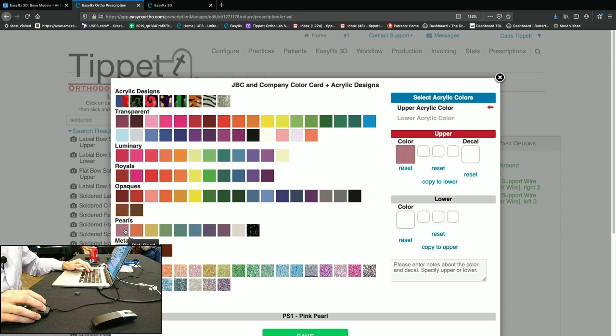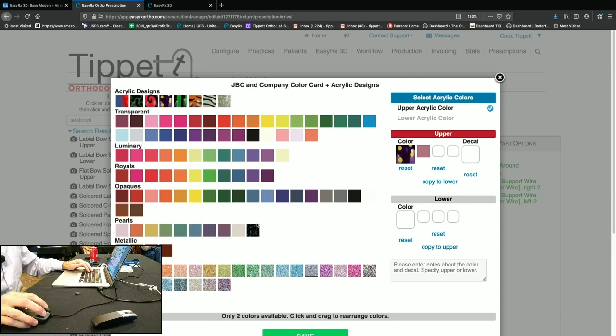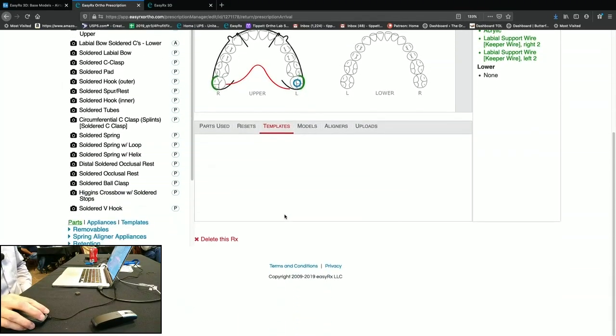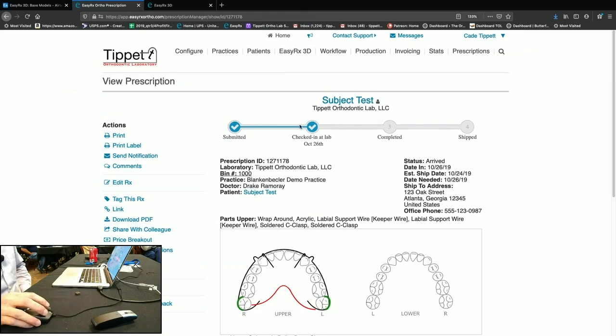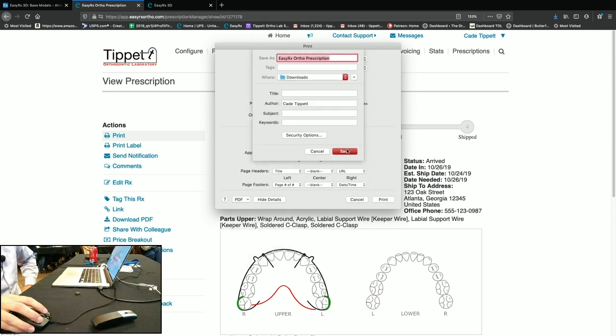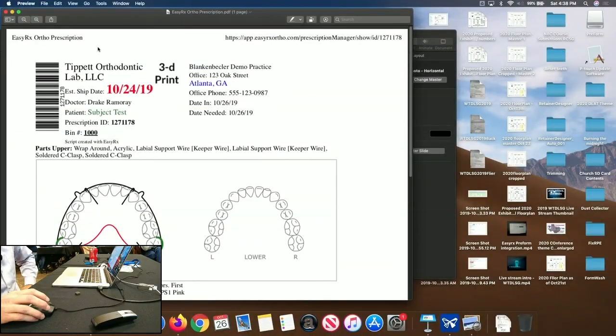So we can do pearl. You can even do half and half or polka dots. So let's say if you do polka dots, you can choose the base color, pearls, and let's do midnight black as the dots, and then save. So then that will tell me what I'm doing. And it's saving prescription, and that's it. And then it's submitted. It's been checked in the lab. When I scan it out, oh, I thought it'd give me a preview. There we go. There's the script right there, ready to print.